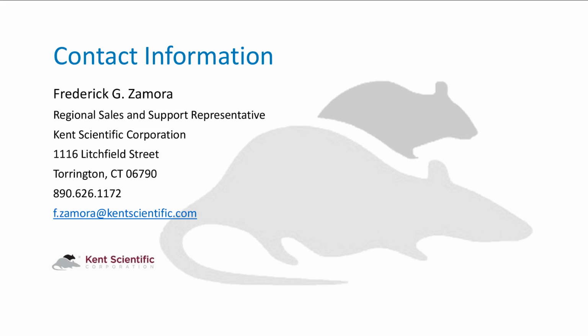And then your last question, how long does a SomnoSuite last more or less with a 10 mil syringe? We do have a chart that I could also send to you that gives you a rough estimate of how long you can expect the syringe to last. So say for 100 mils per minute at 2%, you can expect your 10 mil syringe to last around 16 hours or so.